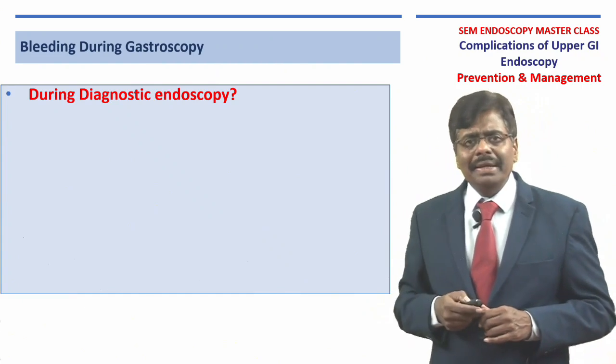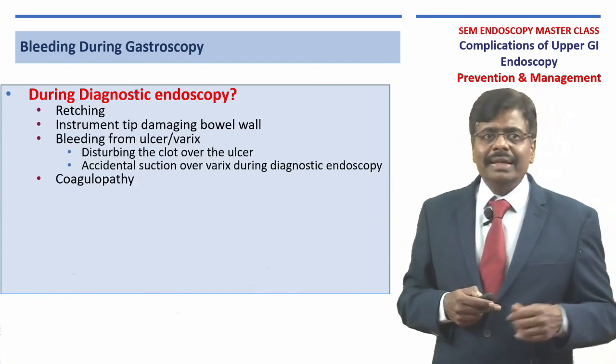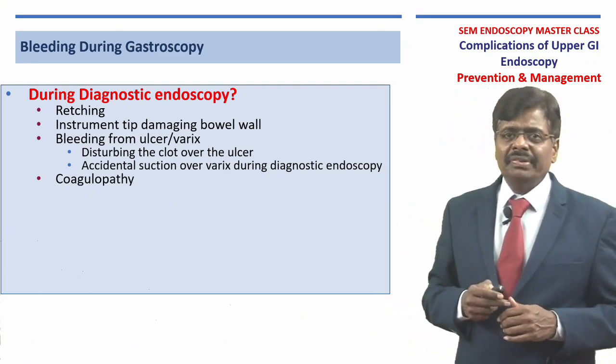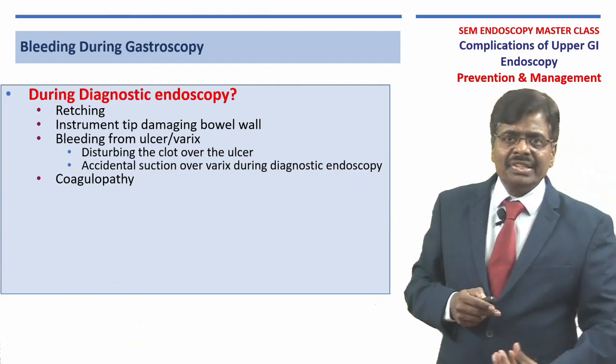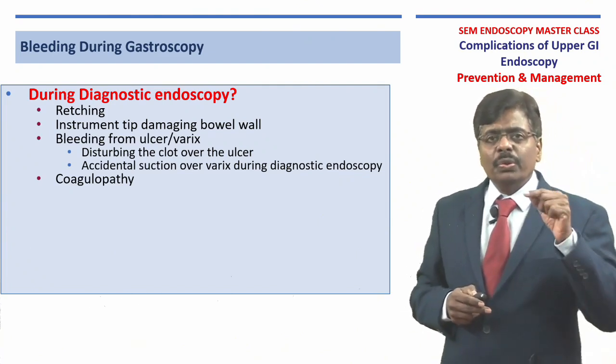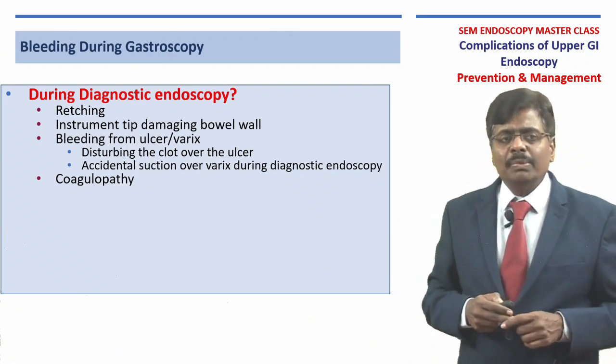And what about bleeding? Can it happen during a diagnostic endoscopy, if you ask me? Yes, it can happen, especially if the patient is repeatedly retching. If the scope is in the esophagus and he is retching, it will be a problem. So, you carefully go in, try to enter the stomach as quickly as possible.